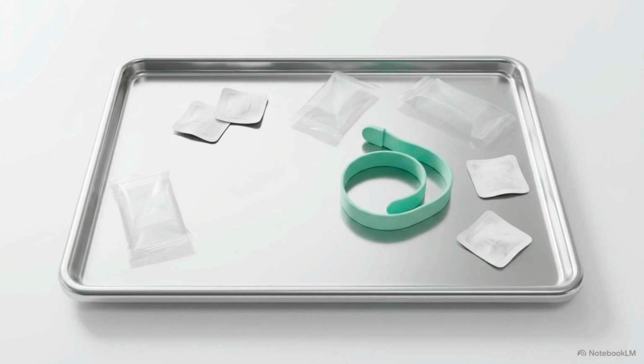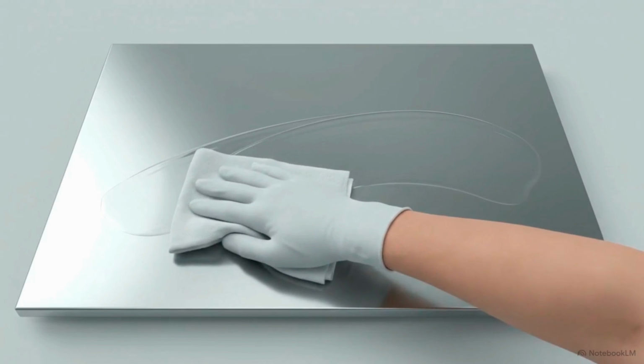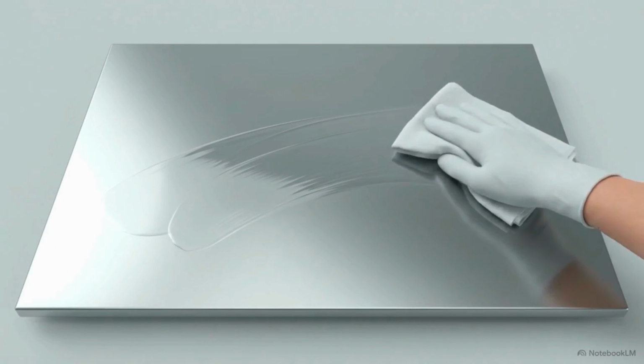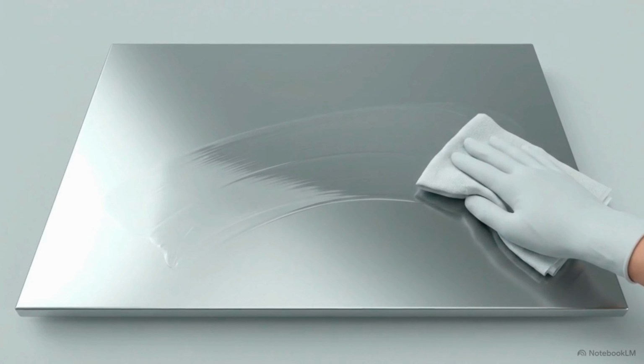Back at the empty workstation, dispose of all remaining blood-contaminated materials and glassware directly into a proper sharps container. Decontaminate the workstation surface thoroughly with an approved clinical disinfectant to completely eliminate the hidden risk of blood-borne pathogen transmission.